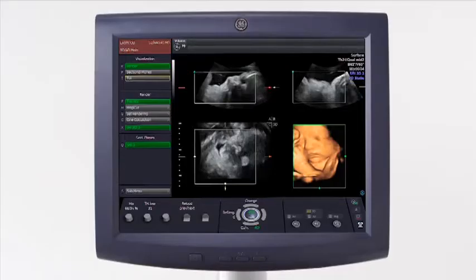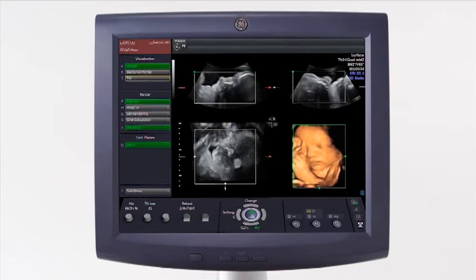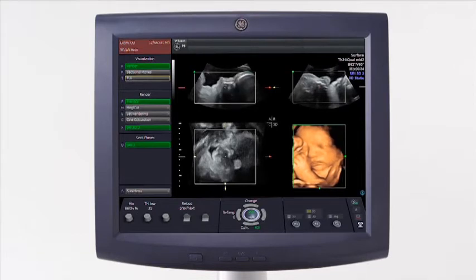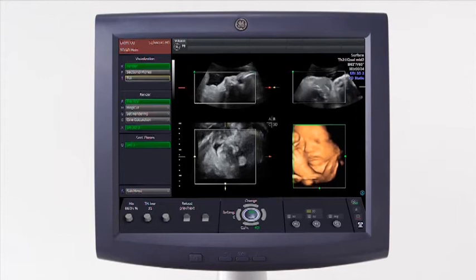After the acquisition, the volume displays in an edit mode. While in the edit mode, the region of interest is still active and the upper trackball key will change between sizing the ROI box or moving the image to the box. Note that the graphic ROI is stationary. The image moves to the ROI.